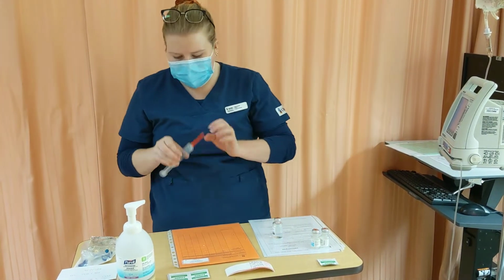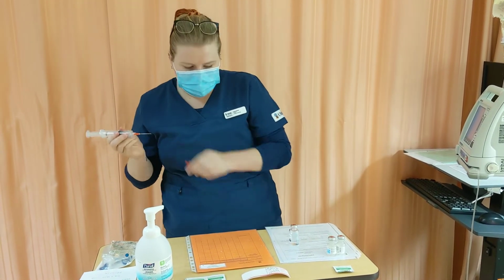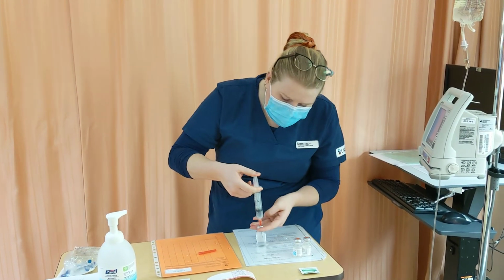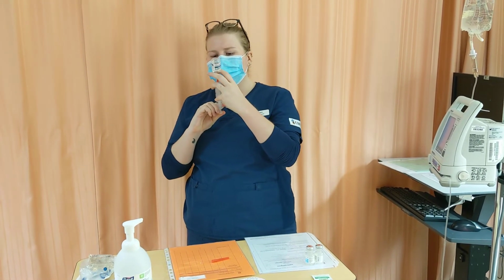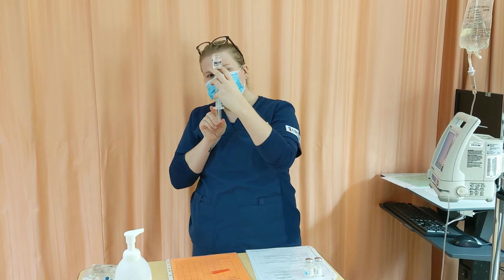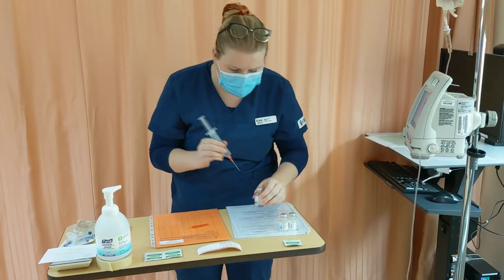Let it dry for 15. I'm going to draw back the 10 because that's what I need for my correct dose. I'm going to go ahead and insert that. I'm just going to draw back a little bit extra so that I can knock out any bubbles.